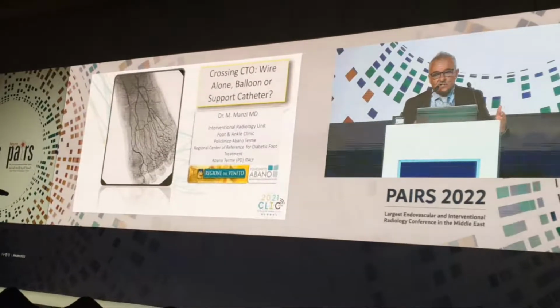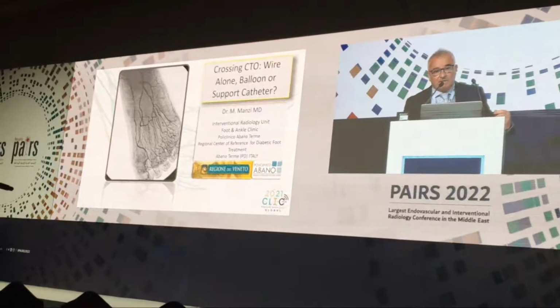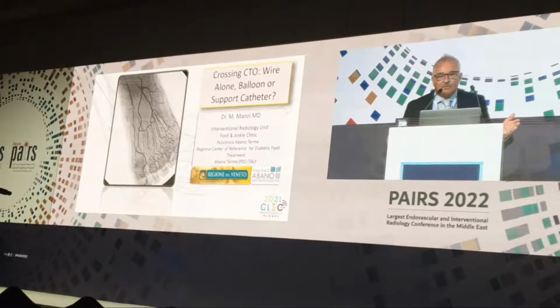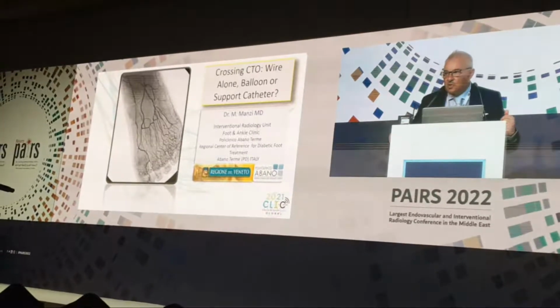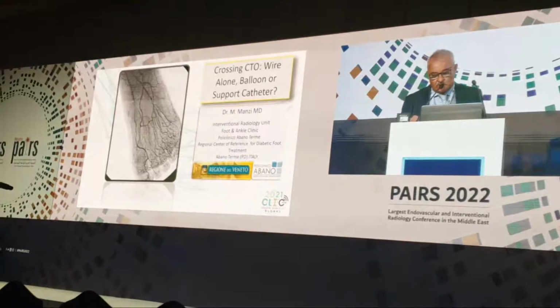And of course, after we treat the lesion, the opportunity and the needs: when, why, and if it's always a good choice, a good opportunity for the patient to receive treatment with a drug-coated balloon.